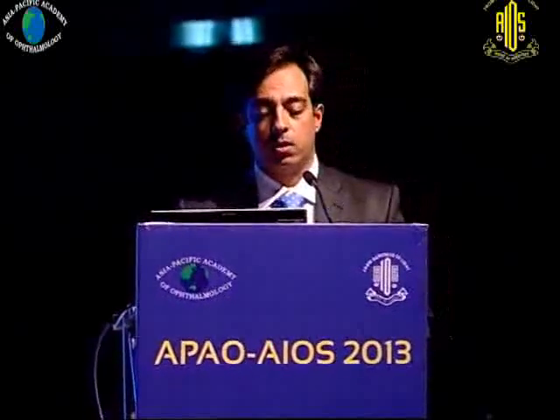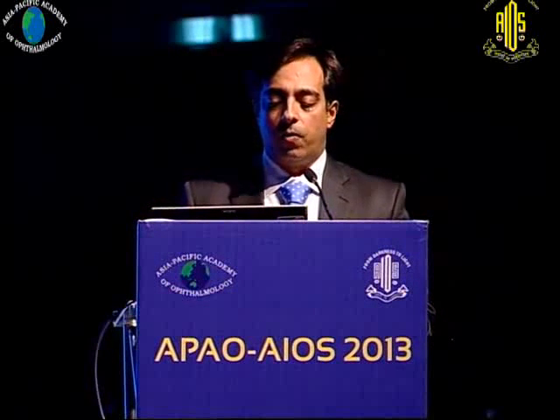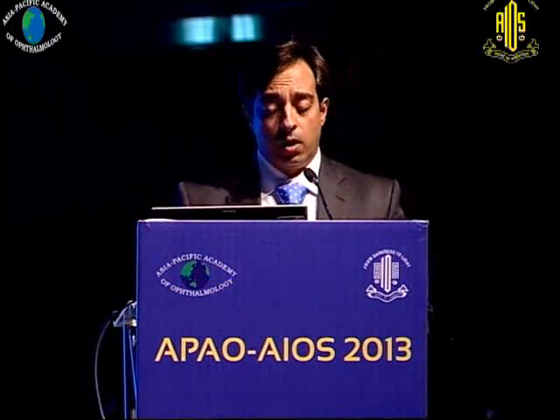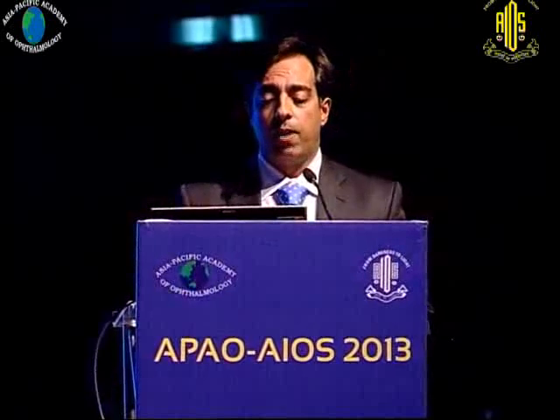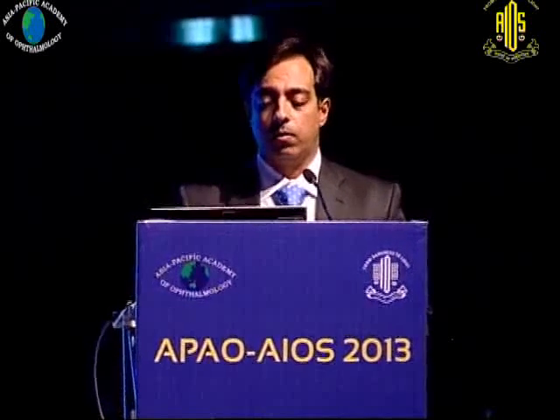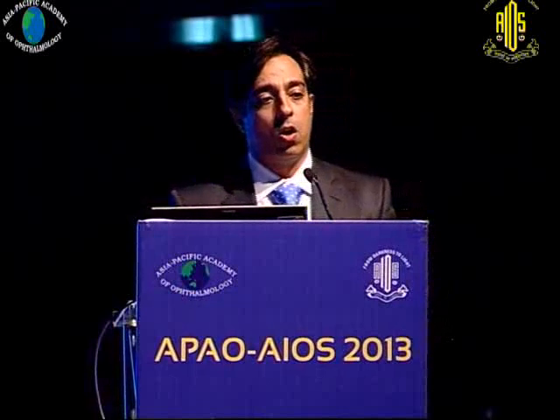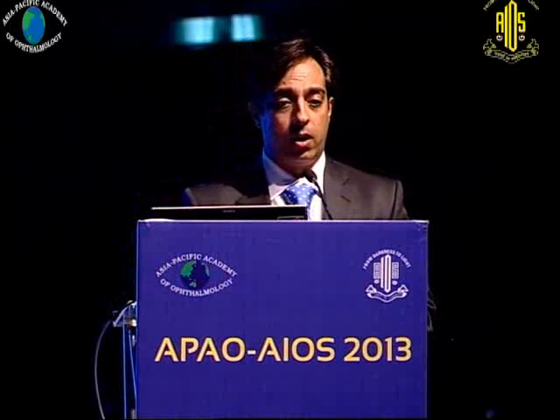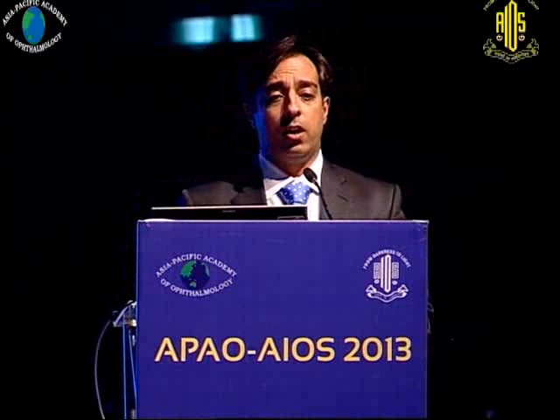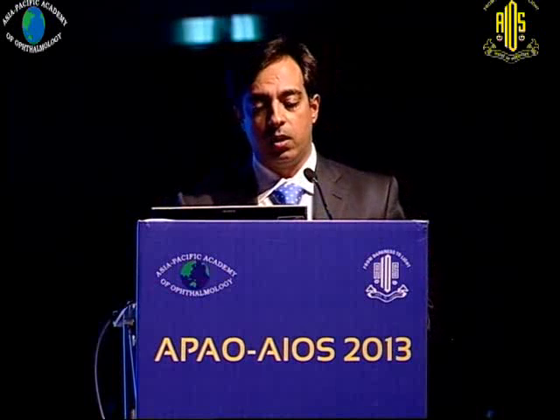This is again a small clip in a detached retina with a puckering in the center, where again our first approach is to remove the vitreous in that particular area, and as you see that we are applying high vacuum after the grasp is seen of the vitreous, and there is a puckering in the macular area, and as we pull at this tissue, you will see that the pucker also comes along. So a lot of these well-formed macular puckers can actually come out with hyaloid. We've all seen cases of spontaneous removal of the puckers in patients when they come for follow-ups at times. So even on table you will see these formations.